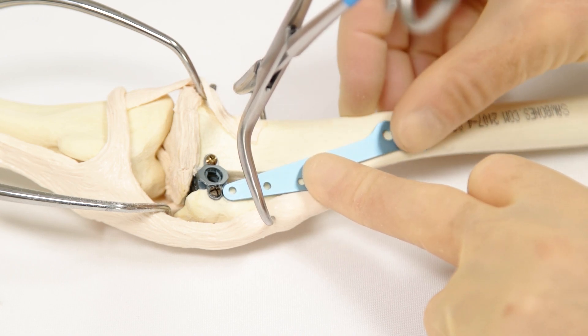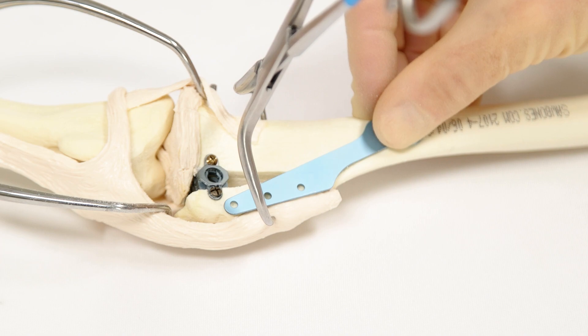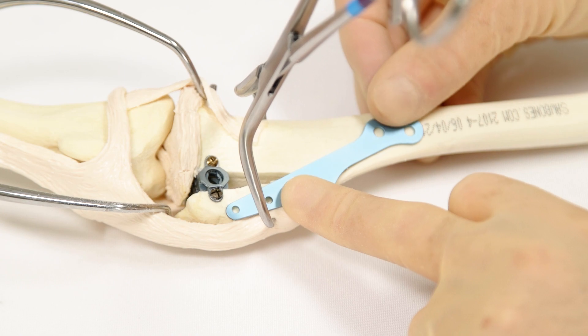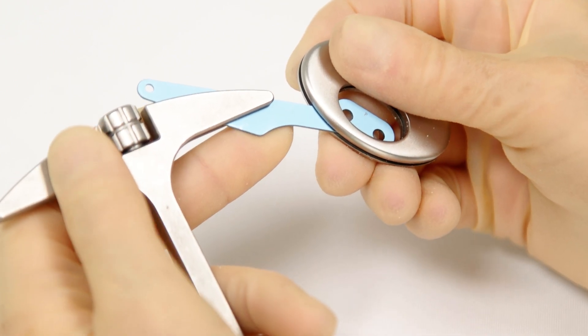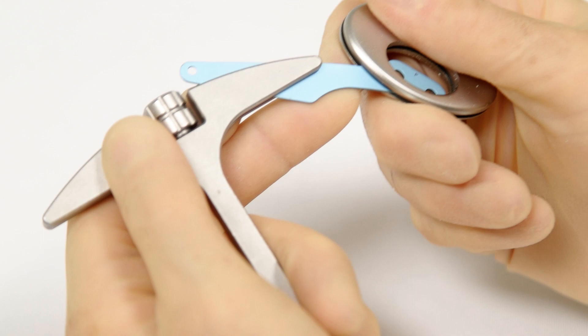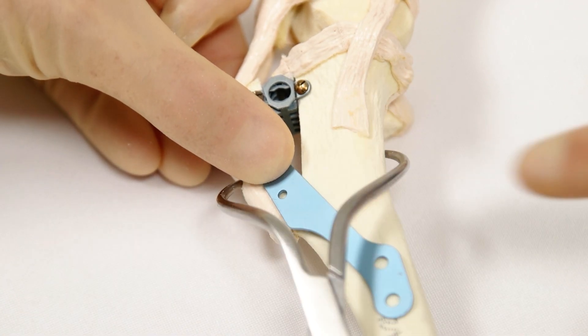With the cage now secure, position the plate, ensuring that the screw holes proximally are clear of the cranial cage screw and ensuring good positioning of the distal plate holes relative to the tibial diaphysis. Gently contour the plate to match the contour of the tibia using the T-handle device and oval plate bender. Position the plate on the tibia so that the screw holes overlie the appropriate parts of the bone.